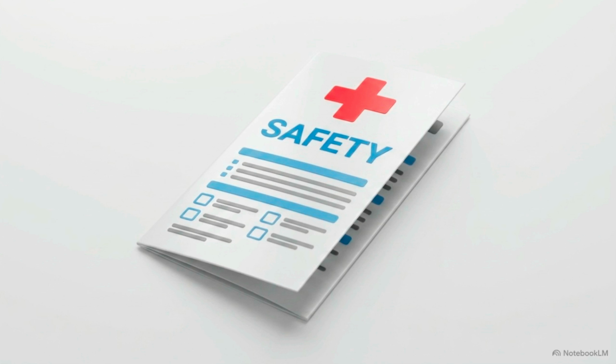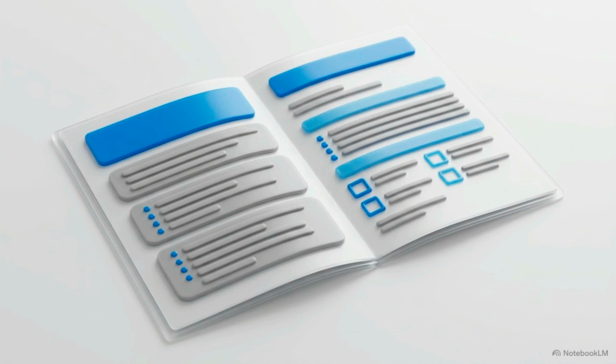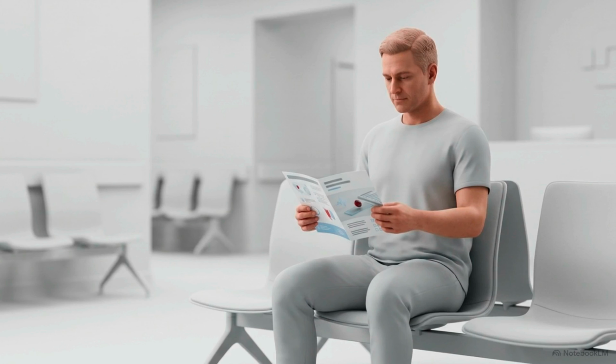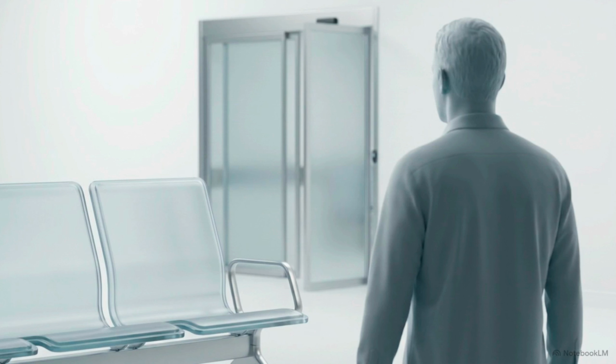Next, you are required to provide the donor with educational materials. These documents clearly outline the risk of relevant transfusion-transmitted infections, specifically detailing the signs, symptoms, and high-risk behaviors associated with HIV and AIDS. Providing this education before the formal interview allows individuals who recognize they have engaged in high-risk behavior to safely and discreetly self-defer, walking away without having to answer uncomfortable questions.